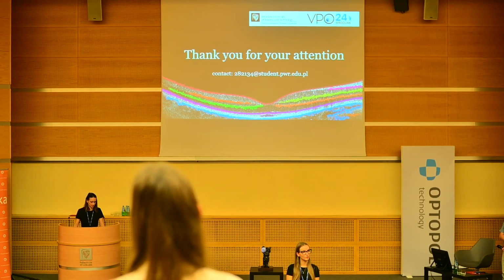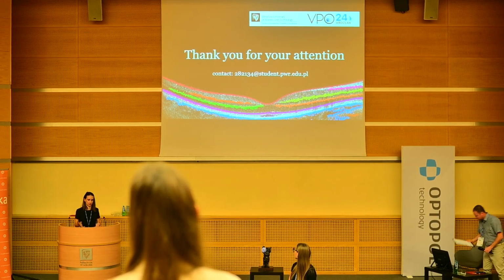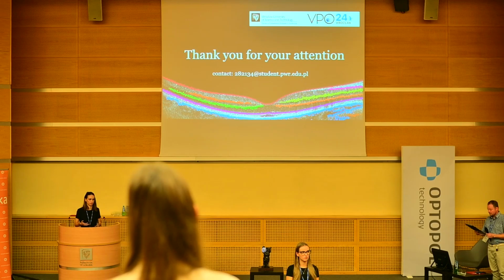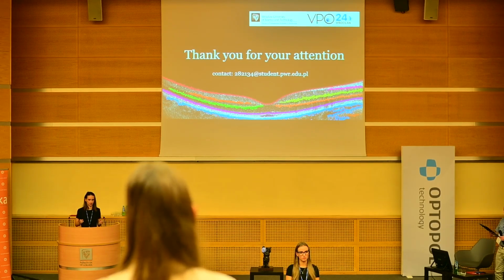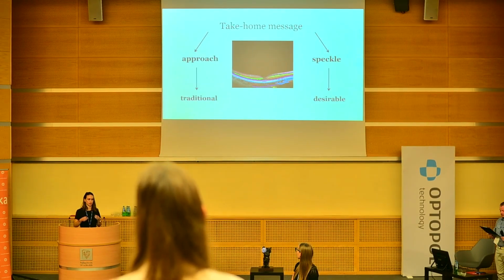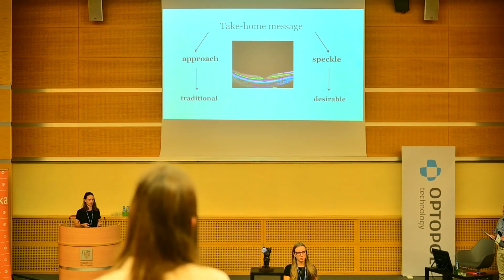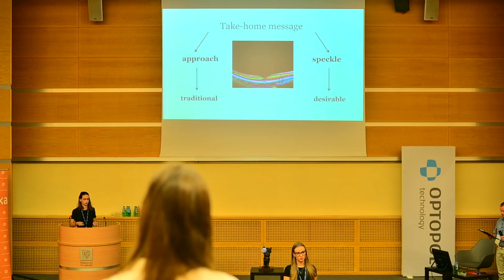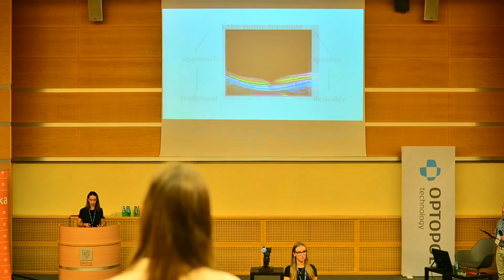That's an excellent question, because that approach was aimed to be an alternative for the machine learning approaches, and like I said on the previous slide, we were interested in searching for the information contained in a speckle, that is, performing segmentation on the non-averaged scans, and that process is much more complicated than the average one.